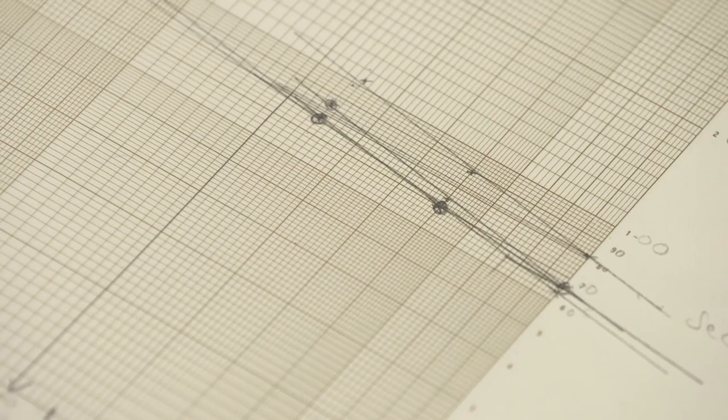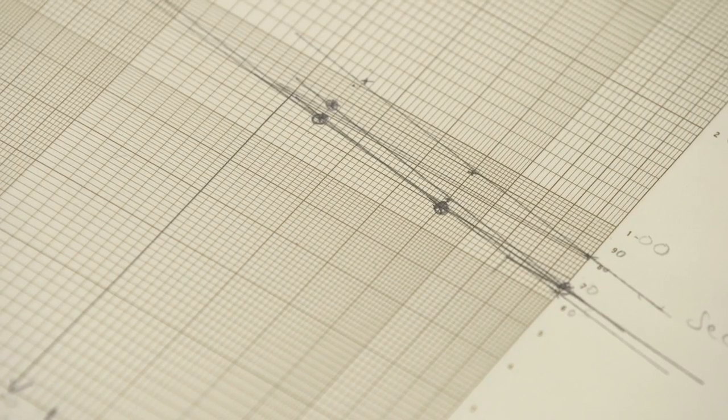So it's not possible to give a fully accurate estimate of the factor VIII concentration. But what we do know is that the higher dilutions will move closer and closer to the truth, closer to the real answer. And if we can obtain 2 dilutions which would give a straight line that's, crucially, parallel to the standard, that's an indication that we've diluted away the inhibitory effect.